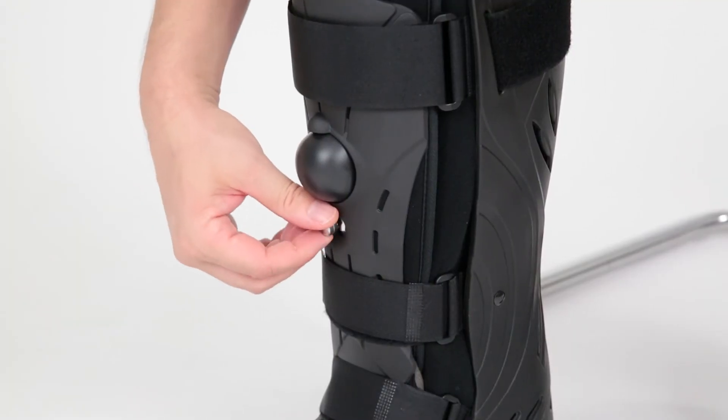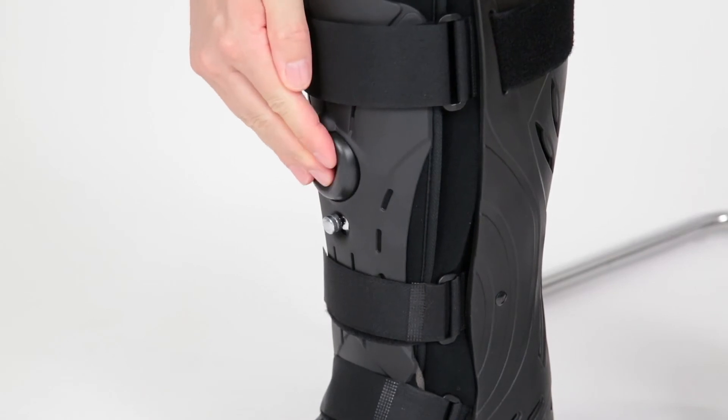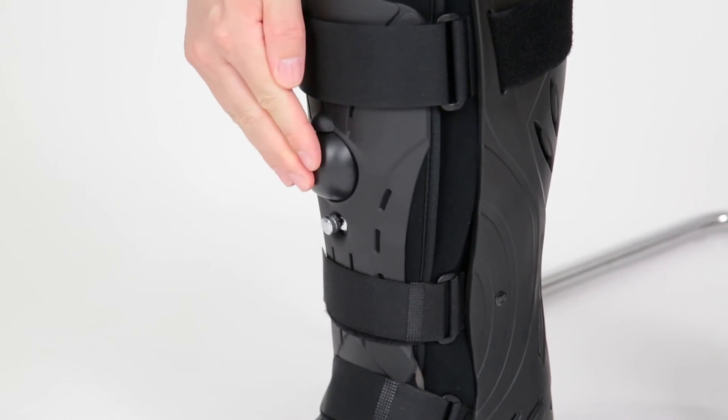Set the air valve to inflate by turning it clockwise, then press the pump to inflate to your desired compression.